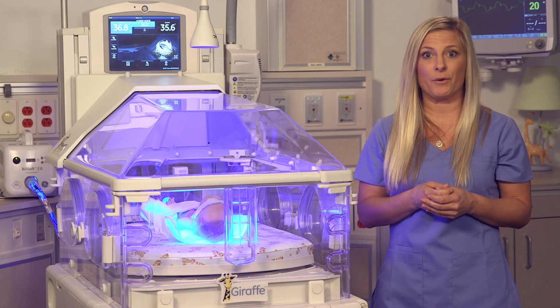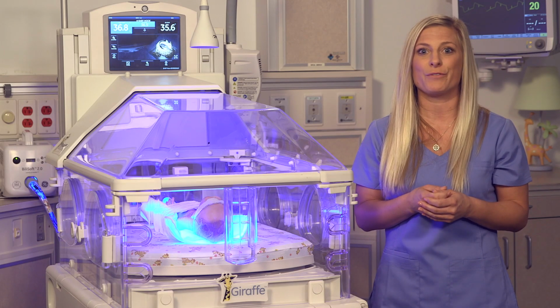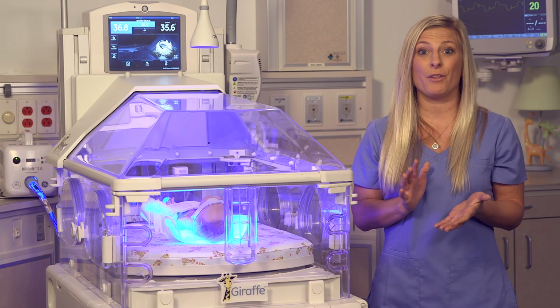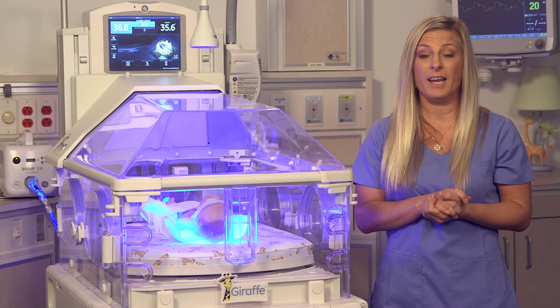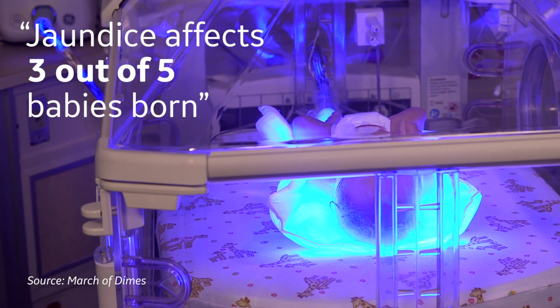So to kick off the phototherapy series, I wanted to quickly share with you the key things that you need to know to use phototherapy. I'm not sure if you all know this, but jaundice is very common and affects 3 out of 5 babies born. That's 60% of babies born.